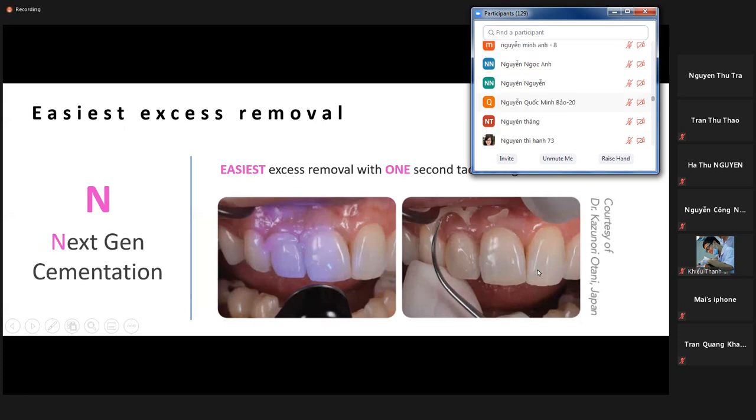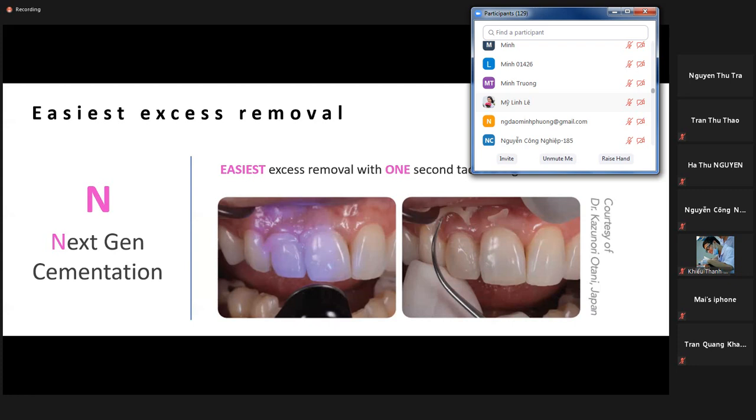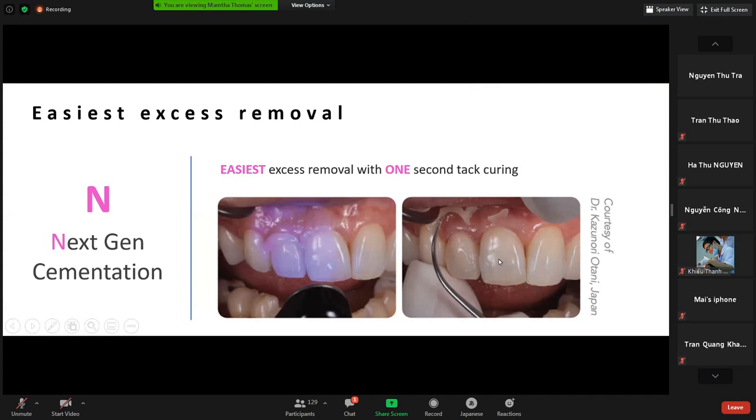But sometimes we may find it difficult to just hold it for 1 second. We may think it's too less and we hold it for longer. Then the cement may harden more. So in that case, we recommend by curing using the self-curing property. So just hold the restoration for a little over a minute and then you can remove the excess cement.